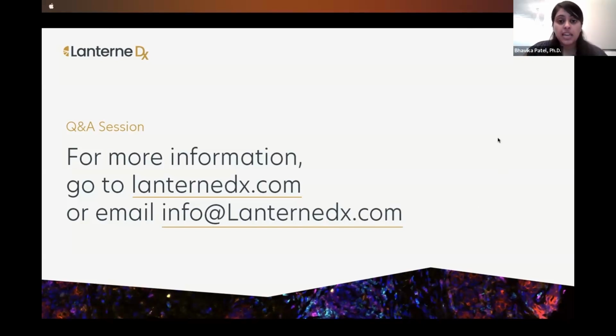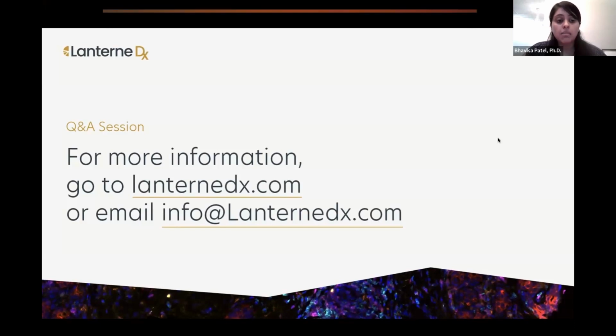Yes, bone marrow samples can be used. We have some bone marrow that we have tested on simple 2-plex, 3-plex assays. We have seen good results with it. And with higher plex, it would just depend on what sort of questions someone is asking. We can definitely optimize a panel. We do have ready-to-use panels that we offer.